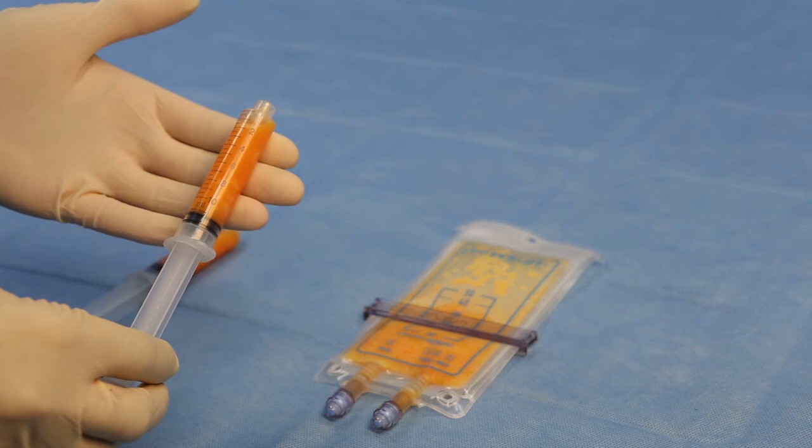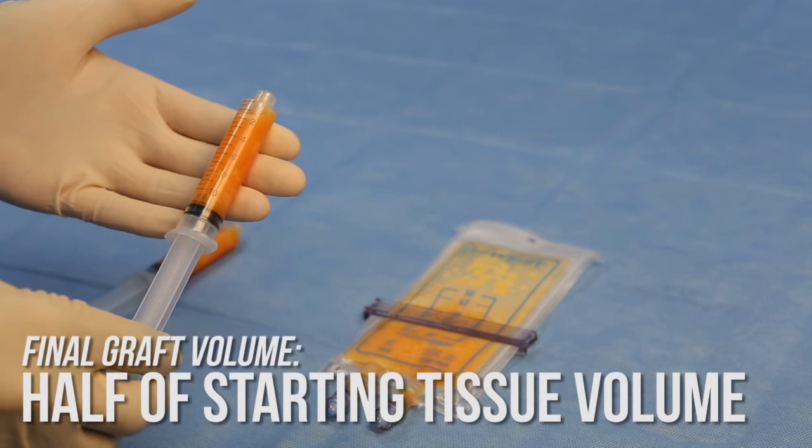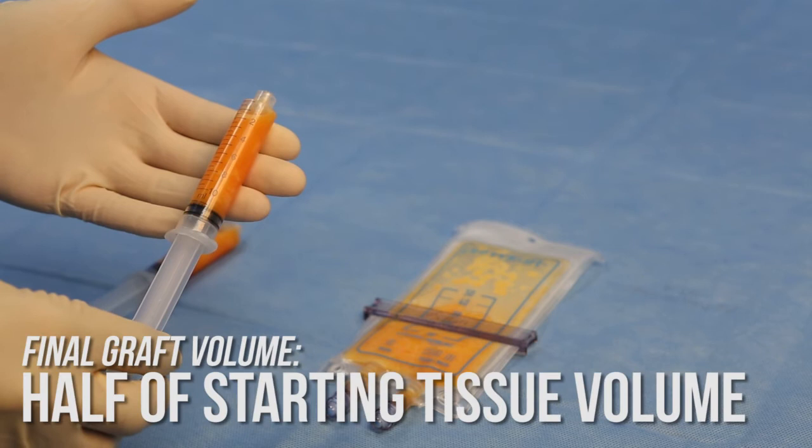The graft is now ready for reinjection. You will notice that the final graft volume is approximately half that of the starting tissue volume. Rest assured, you have not lost any good viable adipose tissue or components in the waste. In about 10 minutes, PureGraft has selectively filtered out excess fluids, free lipids, blood cells, and other contaminants, streamlining the graft preparation process within a closed system and providing a purified graft to deliver to the patient.